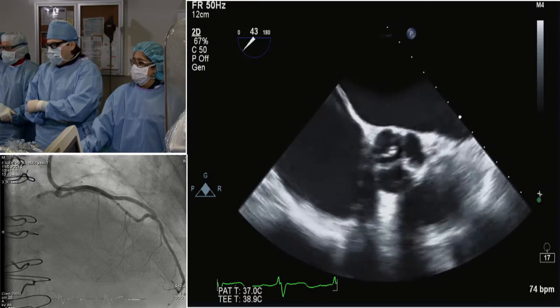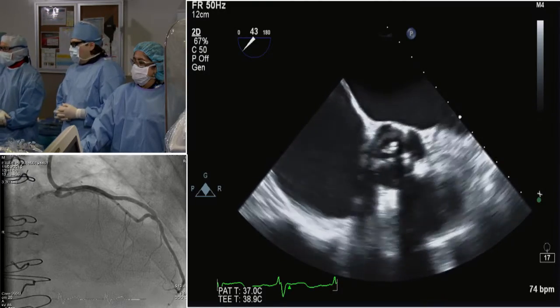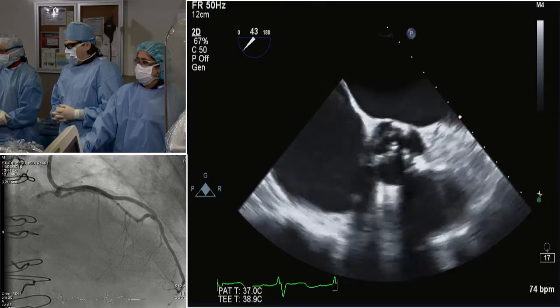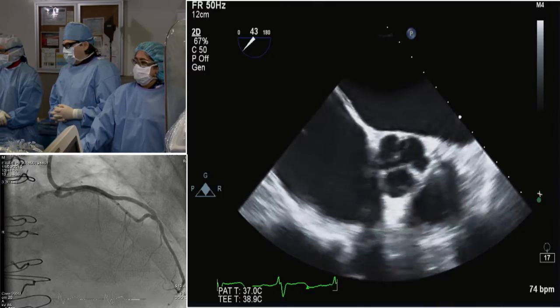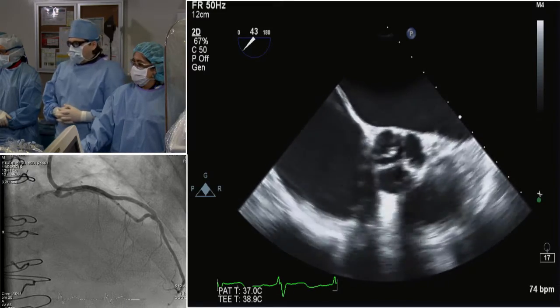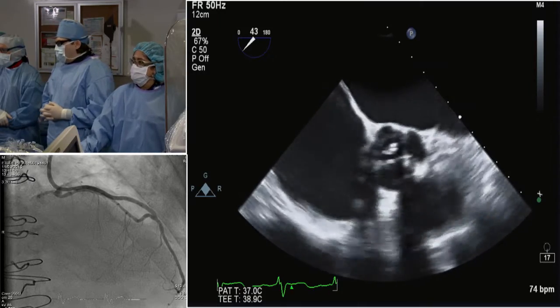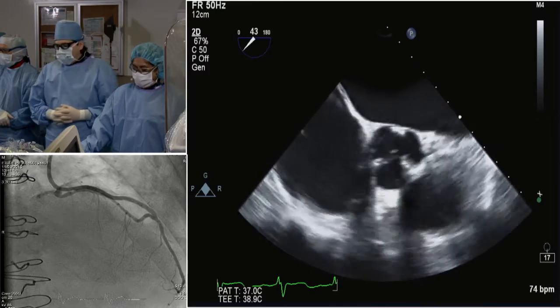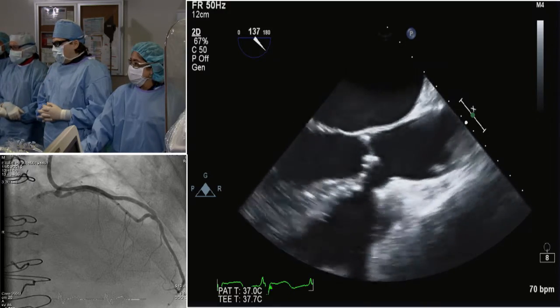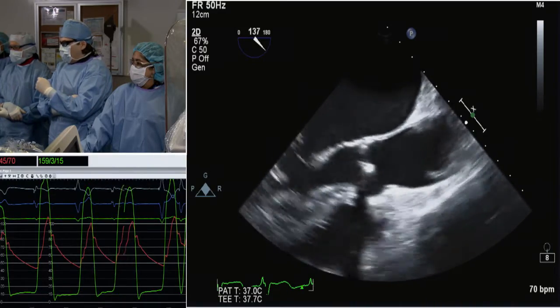JF and Anita and Dr. Cartier, this is Sam Rutherford. Just to respond to you, Nico, I don't see a lot of annular calcification here, and there's no LVOT calcification. So the data that you're presenting, was that stratified by where the calcification is? Because for us, I would look at this and say, yes, the leaflets are heavily calcified, but there's not a lot of annular calcification, no LVOT calcification. I agree with predilatation against the will of my younger colleague on the panel, but I wouldn't be as concerned that we'd have significant paravalvular leak that we couldn't correct with post-deployment BAV.